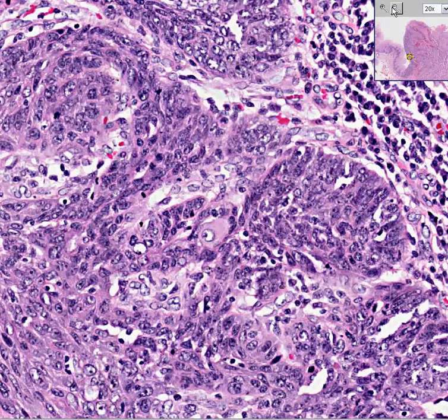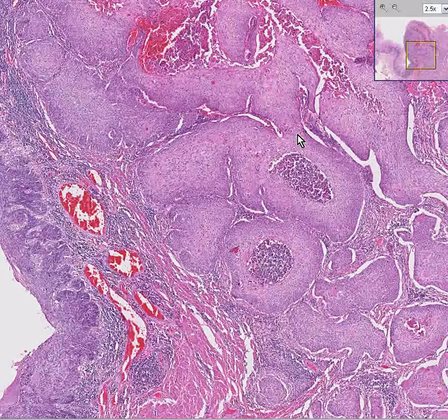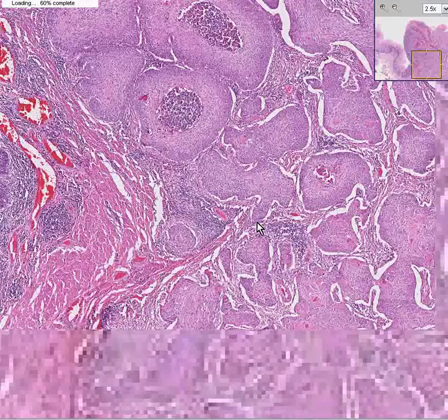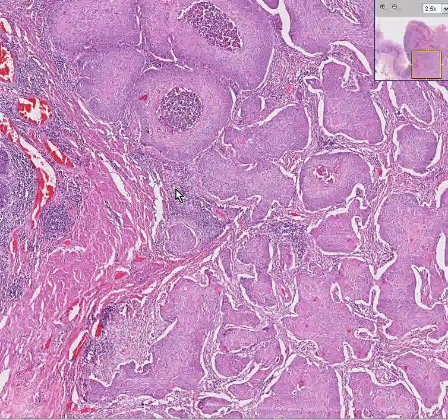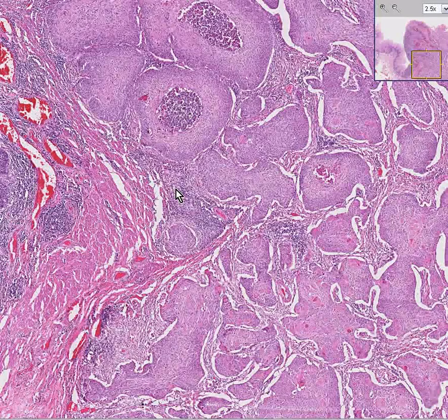Nevertheless, even if theoretically these cells here look perfectly normal, you know that it has to be infiltrating squamous cell, even from this power, because it's invading through these muscle layers. And right there it is. You can see muscle being invaded there. This is squamous cell carcinoma of the esophagus. And it's not the best one I've ever seen, and it's not the worst one I've ever seen. So how about if we call it moderately differentiated? Thank you very much.